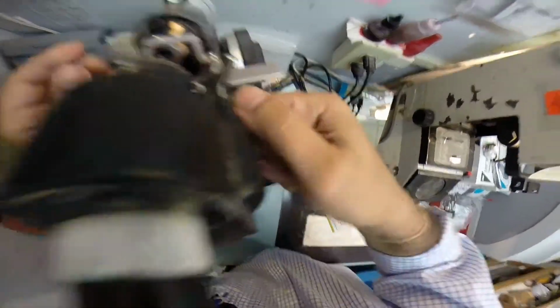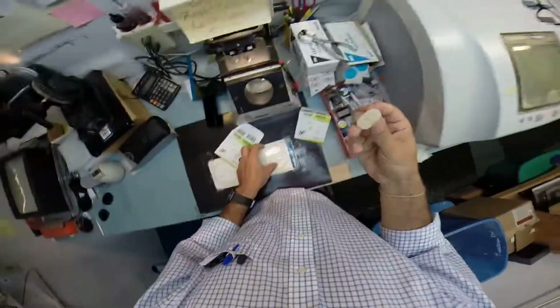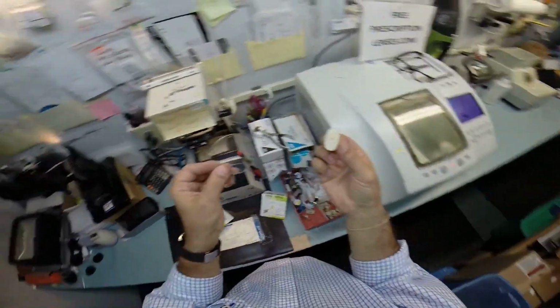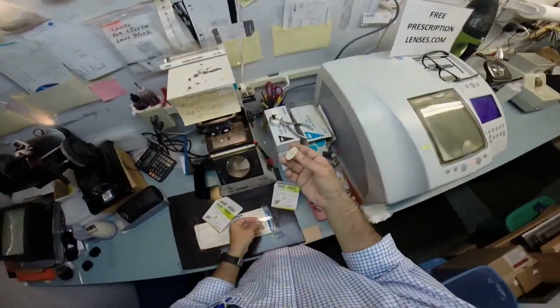Get everything lined up perfectly. Put a dot on the center of the lens. Now this is a block. I like to call it Jenny from the block. It sticks onto the lens with a double-sided adhesive sticker, and this is what's going to hold it in place while it's cutting. So I need to attach that to your lens.